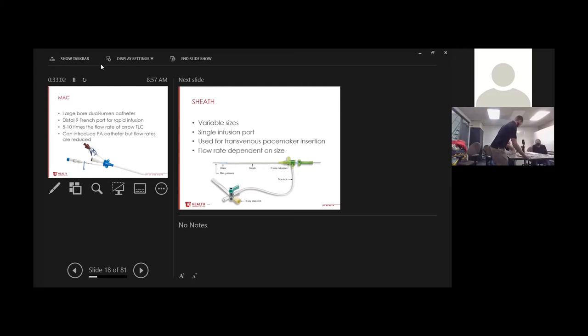So put this down for you. The way that works, this is literally a one-way valve. We're just going to thread it right through. So you're going to see this in two situations: acute trauma resuscitation and MCS flights, not every flight, but the vast majority. In the middle of it, you can put a 5.